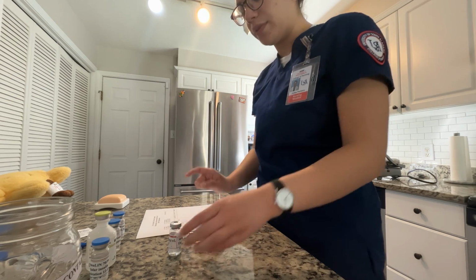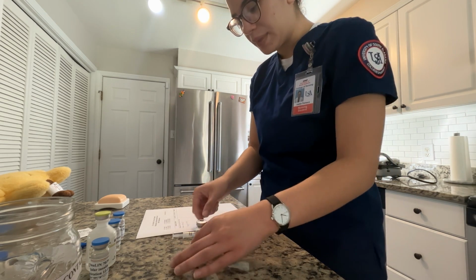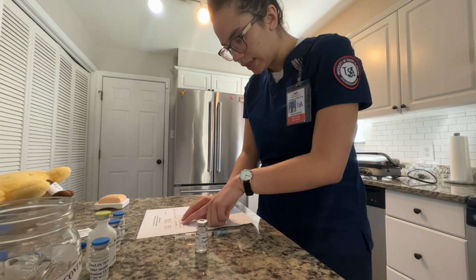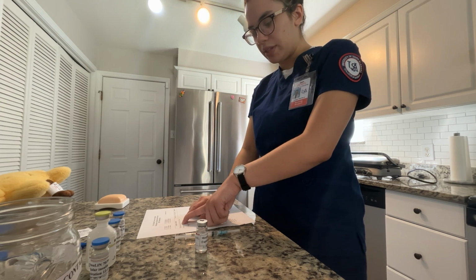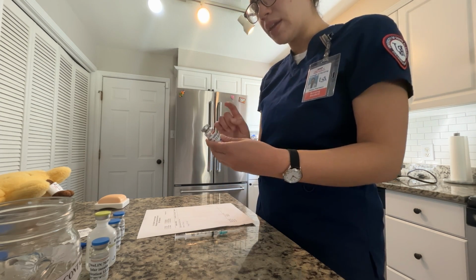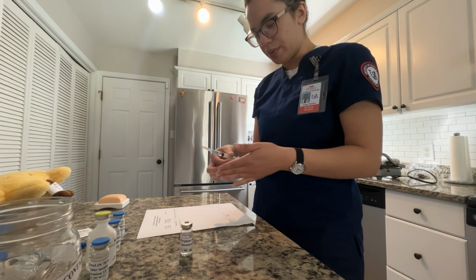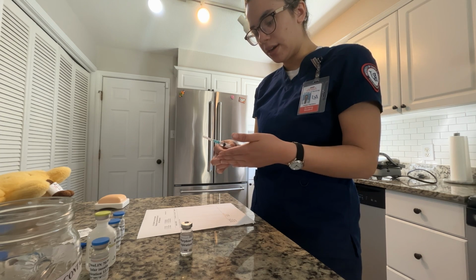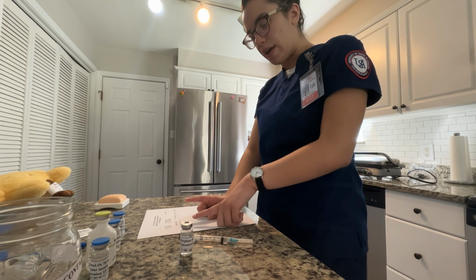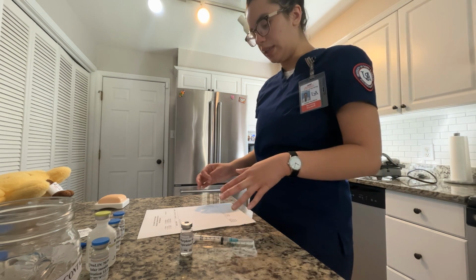He is to receive morphine sulfate. So here in my vial, I have morphine sulfate, and then here in my syringe, I drew up morphine sulfate. He is to receive 5 milligrams of this medication. So I have a 10 milligram per milliliter vial of morphine sulfate, and then here I drew up half of a milliliter of morphine sulfate, and I had to convert from milligrams to milliliters, and I got 0.5 milliliters.